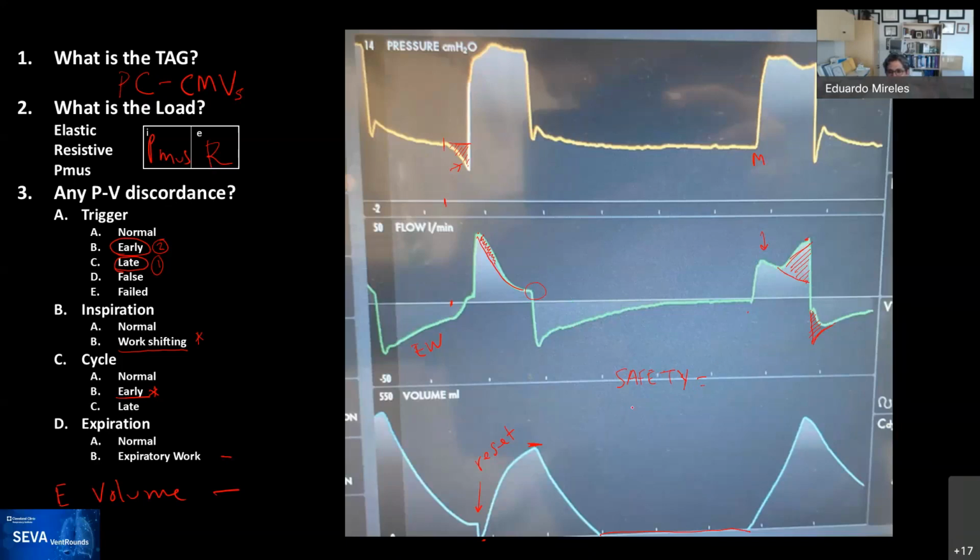Yeah, so this is pretty cool. We're seeing the two paradigms occur right now. The road divides into two pathways in my mind. One road is to sedate more, to paralyze more, and the other road is to decrease the rate or even decrease sedation. And you're going to say, what is this guy talking about?